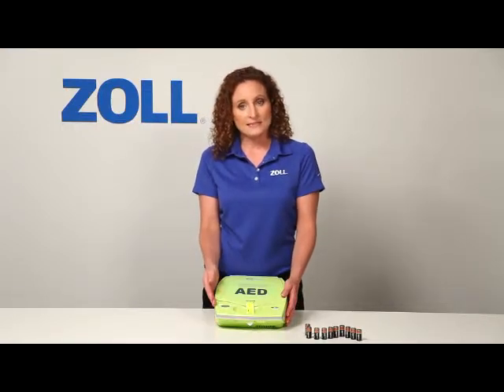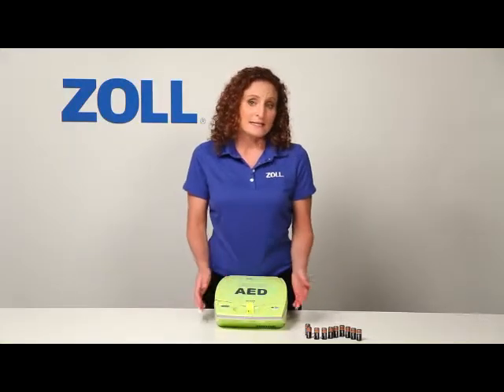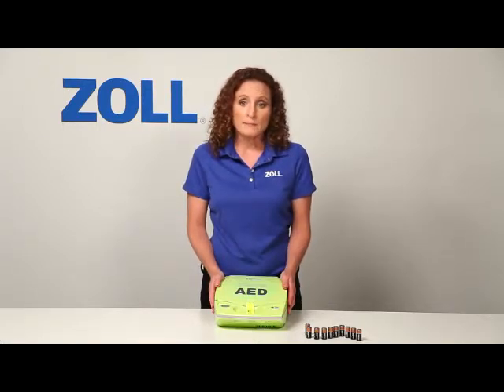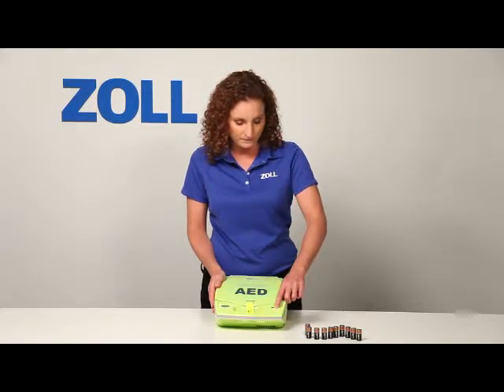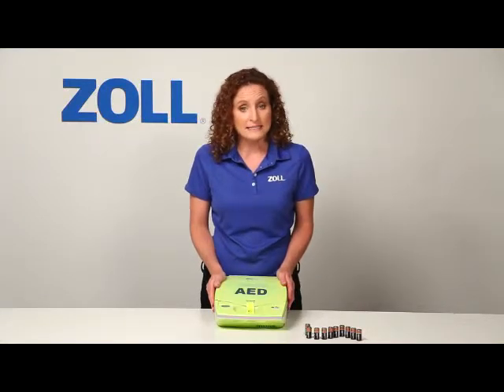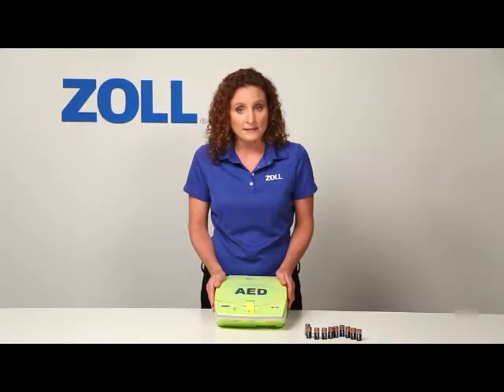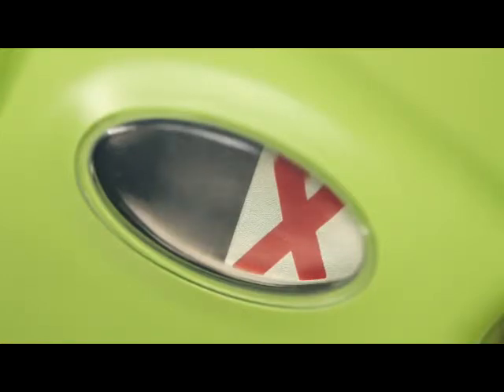Notice how easy it is to inspect the readiness of the AED. Check the expiration date of the pads by looking at the date printed on this tag that extends from the lid. You can conduct a self-test of all critical components by pushing the on-off button down and holding for 8 seconds. The AED Plus performs the same test automatically on a regular basis and presents a green check in this window if it passes, or a red X and a beeping alarm if it fails.